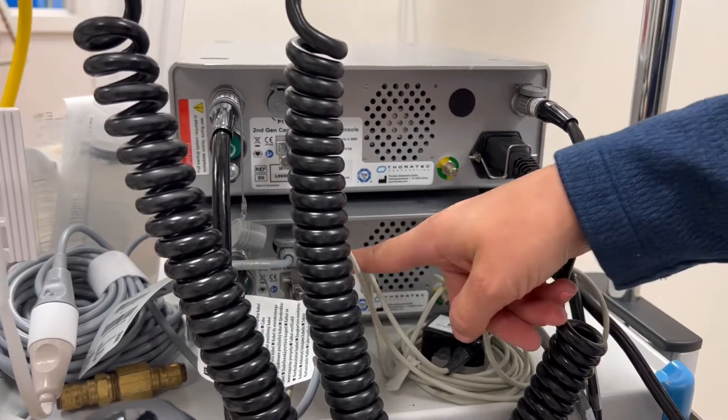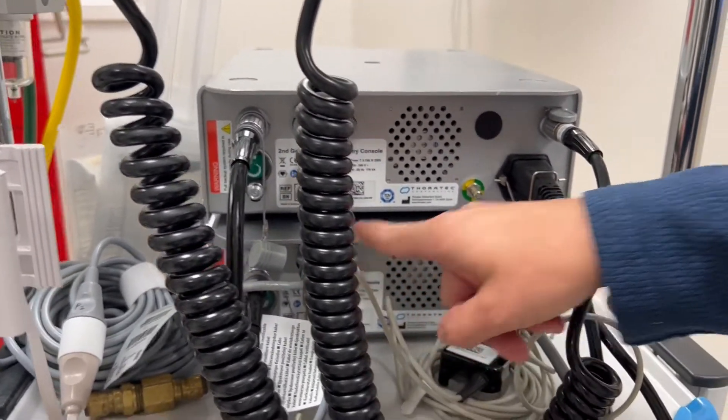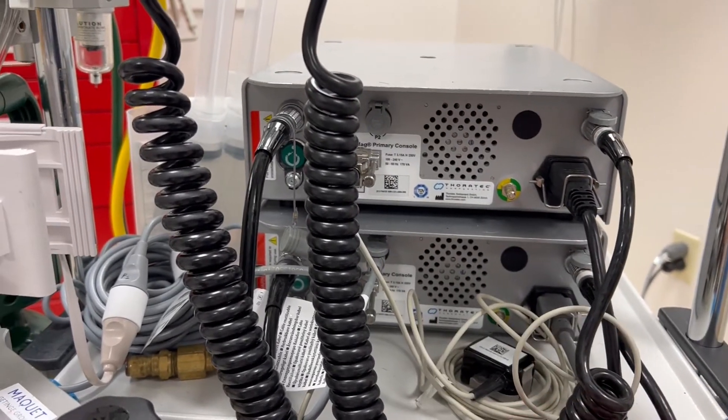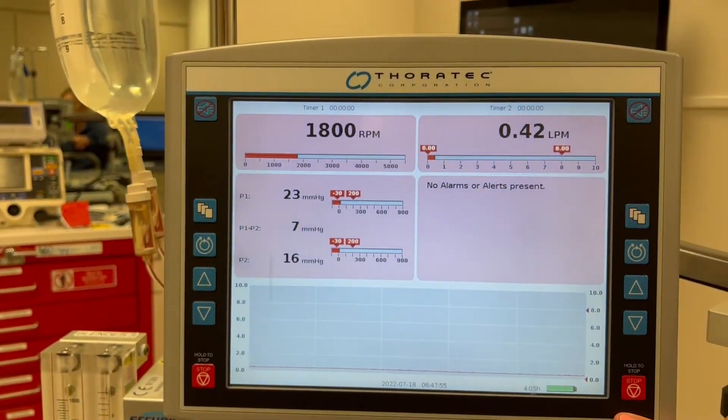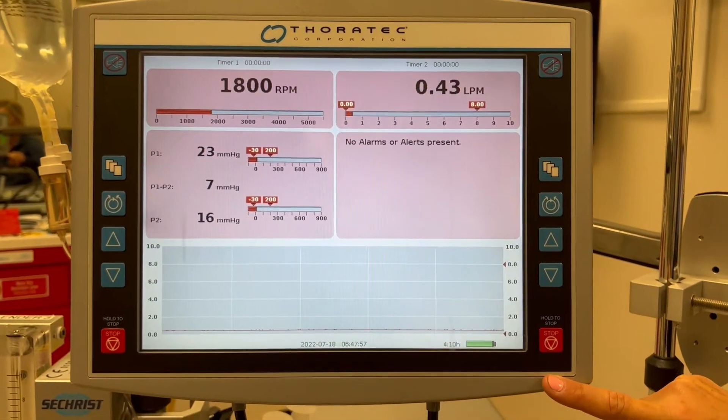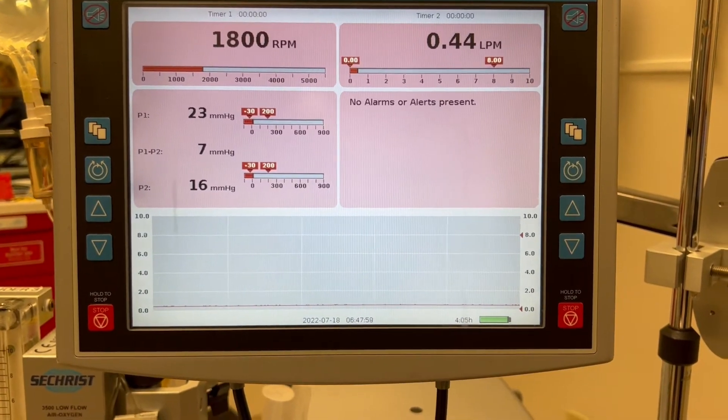The consoles contain our power sources as well as our pressure lines and ancillary components like our flow probe. The console itself has a display on the front and a screen that shows us everything we need to know to ensure our ECMO system is in working order.